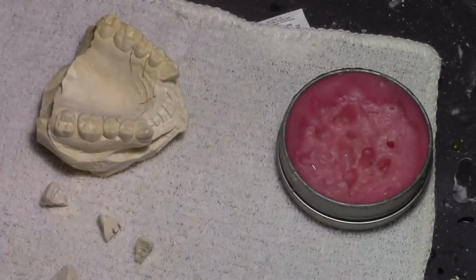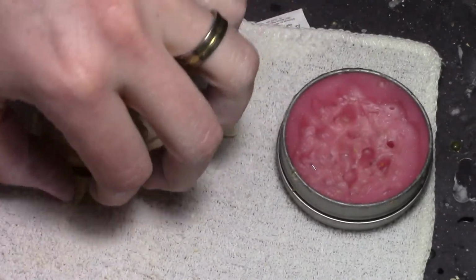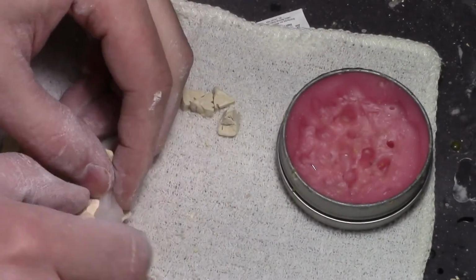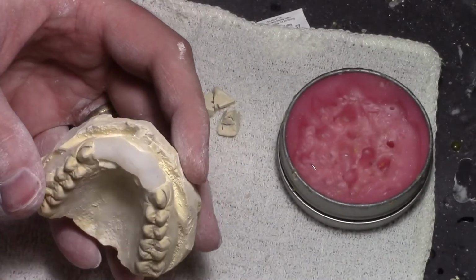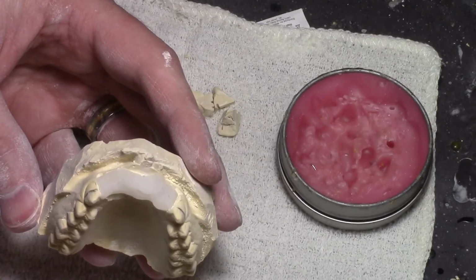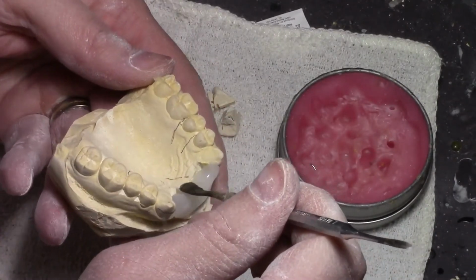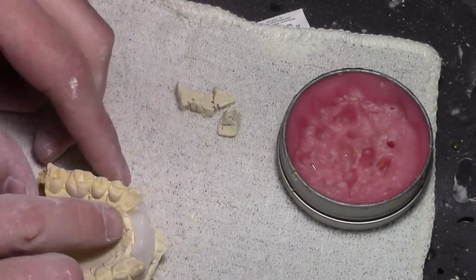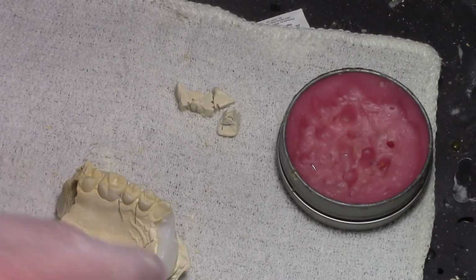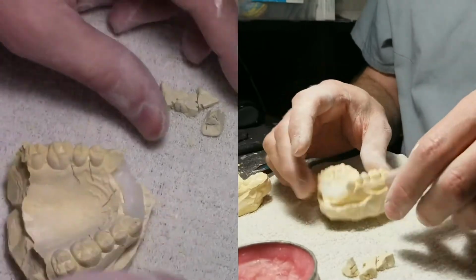Okay, same thing as before. I get this utility wax. I'm going to get 2 strands of it this time, because these actually have to drop down. If you remember, it's an open bite, so there's going to be a lot of wax underneath it. Take my waxing instrument here, my number 7. Okay, so I usually tack it down so that it won't slide around on me. Okay, get a good shot here.